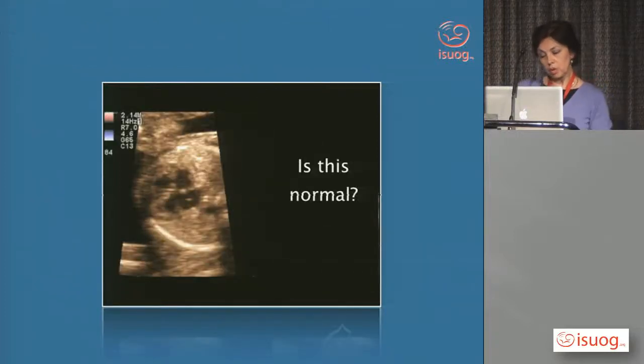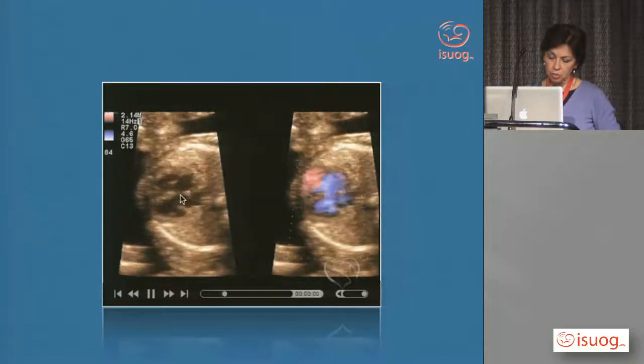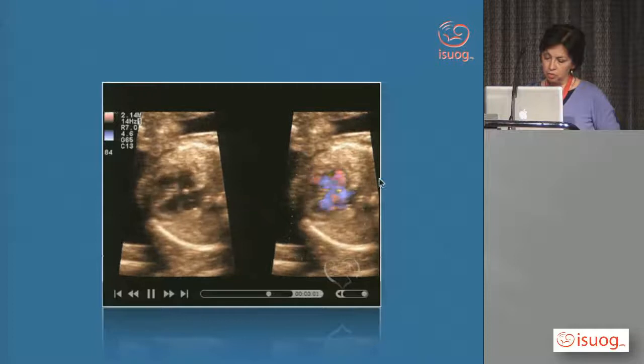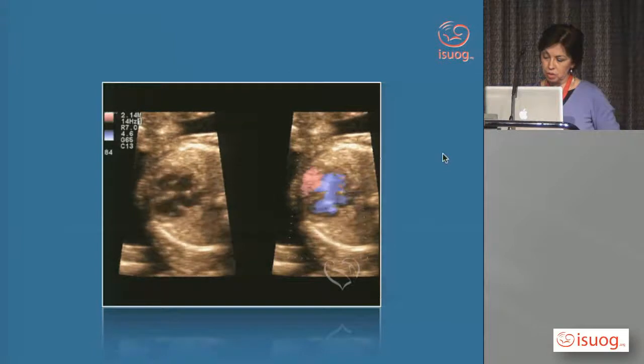Now, I'd just like to point out a few of my last images, it's not going to be very long, that you can quite easily, even if there is a very obvious defect, show a heart that is near normal. And I think that's very frightening in a way for people who are doing their screening. So you could see something like that on a still frame and think perhaps that's normal, when it's clearly abnormal with a primum defect, a ventricular septal defect, and a common valve with a single orifice, and you can see a lot of shunting going across in that area of the atrioventricular junction.